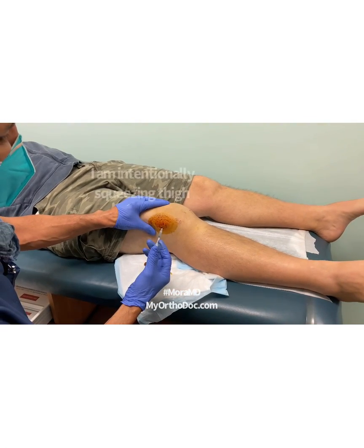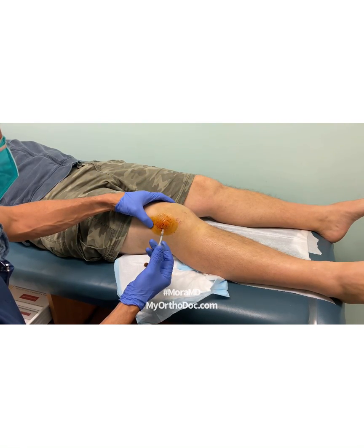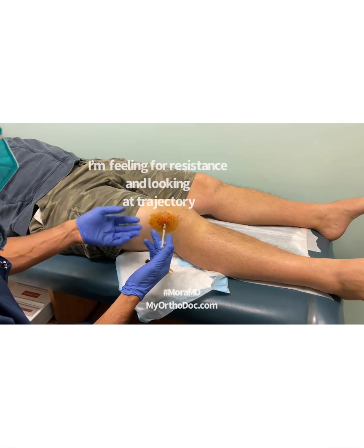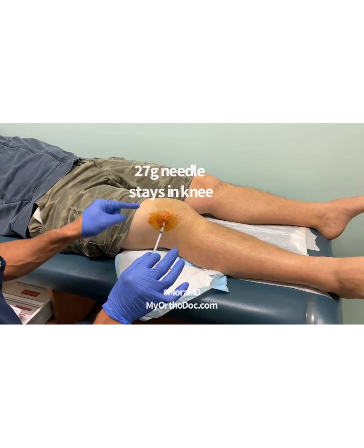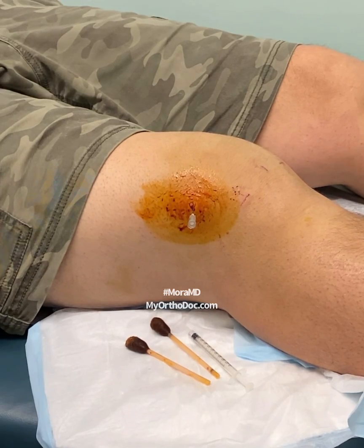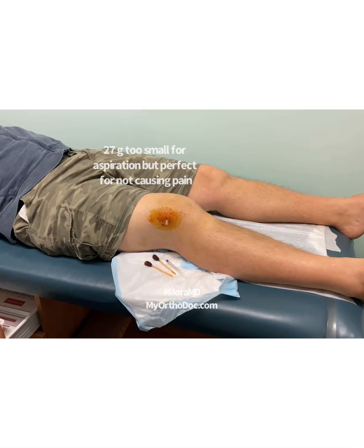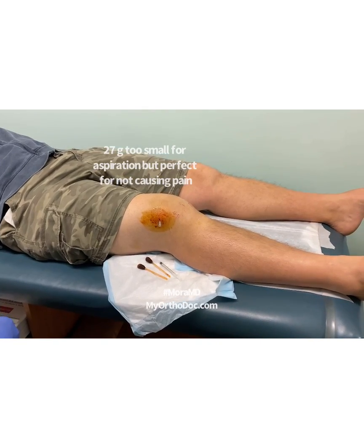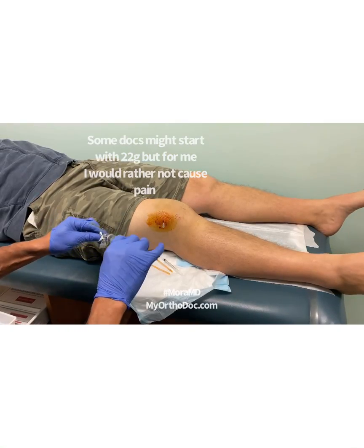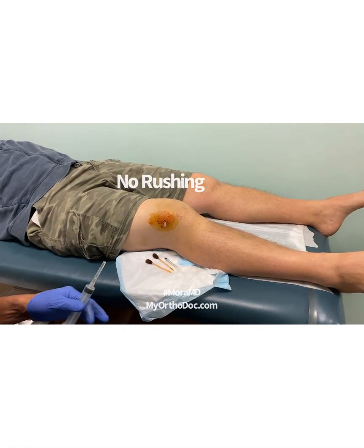Sometimes the 1% lidocaine stings a little bit. I'm using a 27-gauge needle, which people can hardly feel. While I'm doing this, I'm also feeling the patella, making sure I'm in the right spot and the right plane. Then I'll take this syringe off and keep the needle there to help me with trajectory for step two — switching to a slightly higher caliber 22-gauge needle, because blood often does not come through a 27.